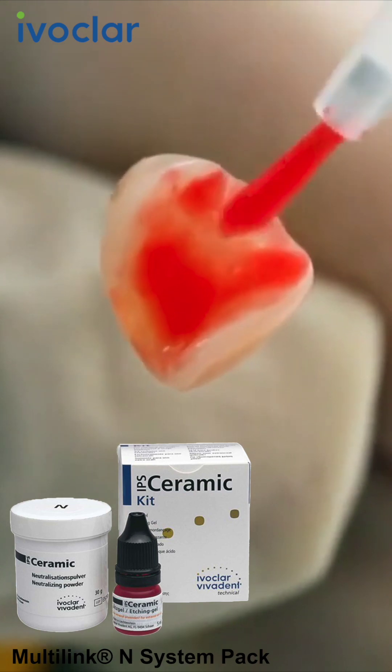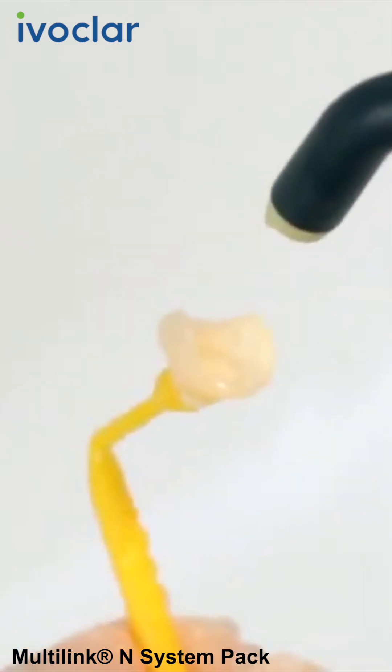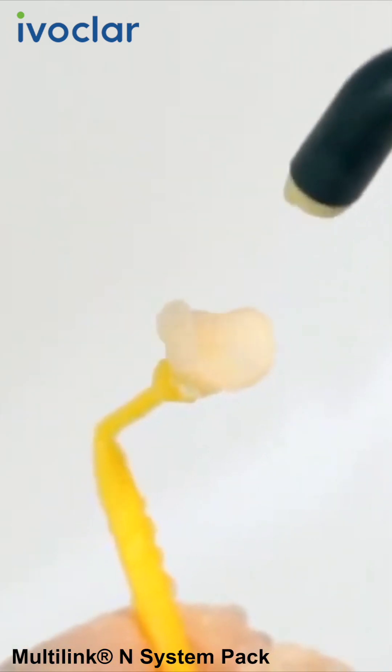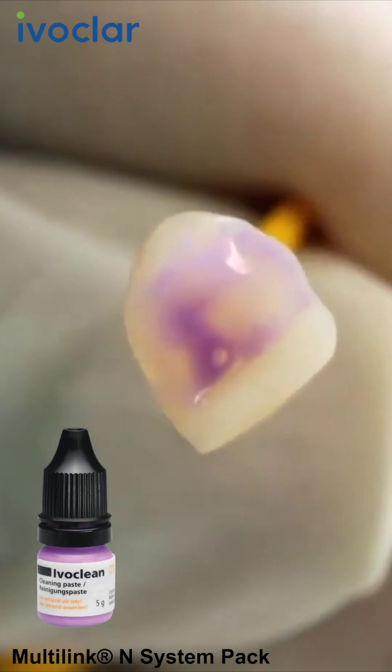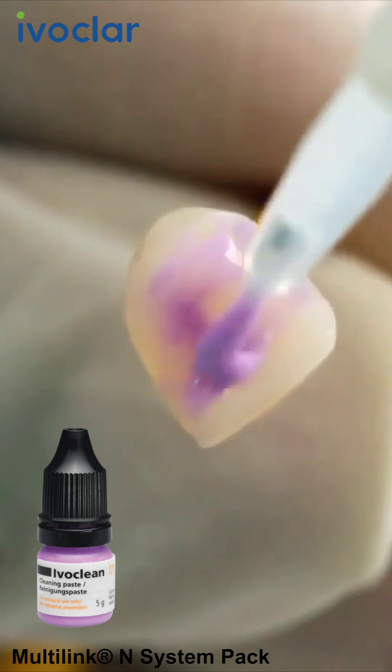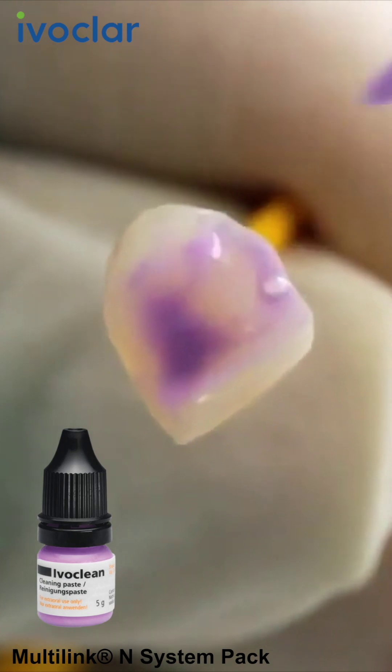Subsequently, rinse off the etching gel and dry the restoration. If the restoration has already been etched in the lab, clean the bonding surface with Ivoclean. For this purpose, apply Ivoclean to the entire bonding surface and leave to react for 20 seconds. Subsequently, rinse it off and dry the restoration.